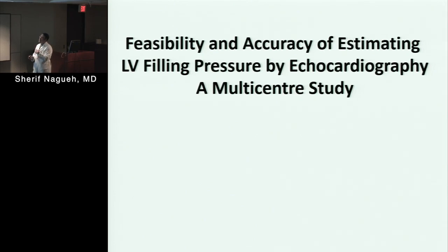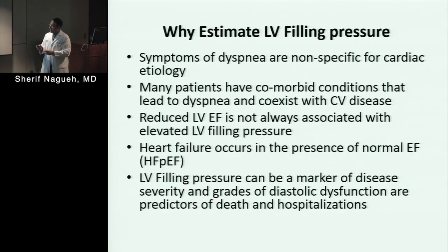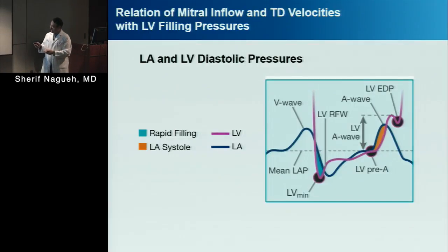So I'm going to show you a multi-center study, some background about the term LV filling pressure. When we talk about LV filling pressure, some of you may be familiar with that, but the talk was prepared for people who may not necessarily be familiar with these terms. So basically, when we talk about LV filling pressures, we are talking about LV diastolic pressures.